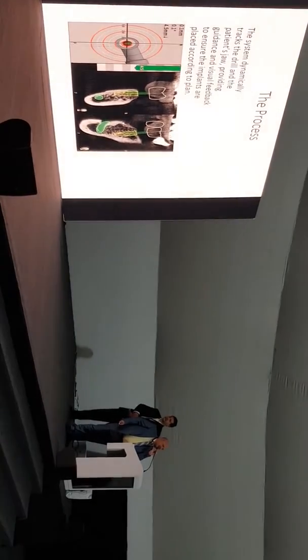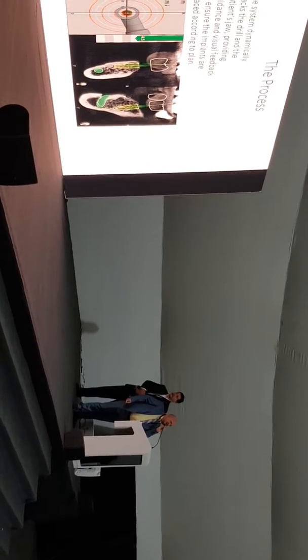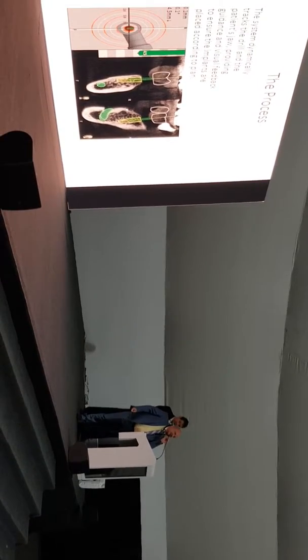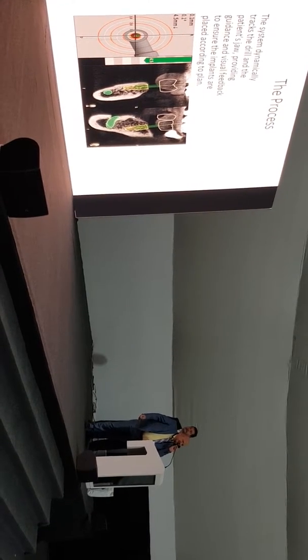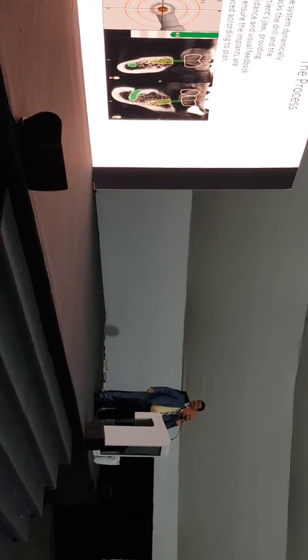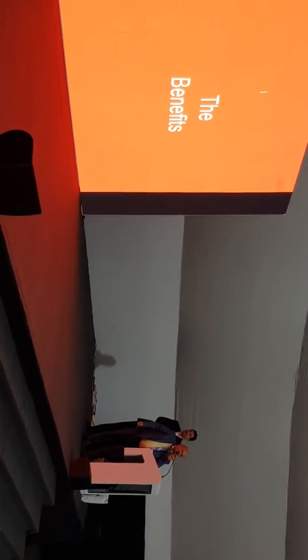It also helps in any kind of surgery, to harvest a bone block or to do a root resection. We can do it safely and in the correct way, because everything is facing us on the screen, so there is no way to make a mistake. Like driving our car, if we go the wrong way, the GPS tells us, no, wrong way, turn.